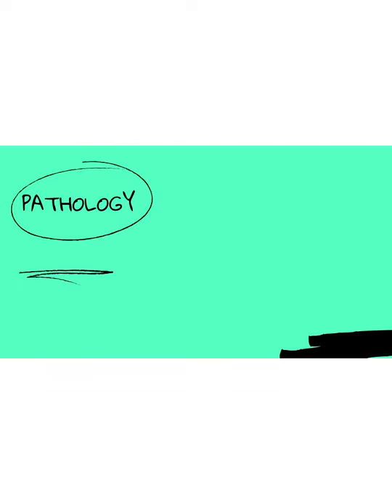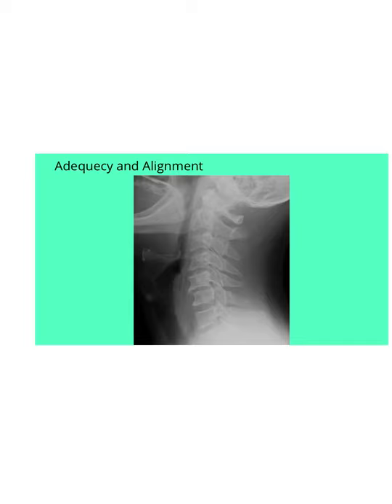Let's put this into practice and look at some pathology. This is a lateral c-spine x-ray of a patient who experienced some trauma. You can see there are no patient details and no indication of time or date. Moving on to adequacy, this x-ray is adequate — we can see all the vertebral levels: C1, 2, 3, 4, 5, 6, 7, and then the top of T1. Looking at alignment, here's the anterior line, the posterior line, and lastly the spinal laminal line.